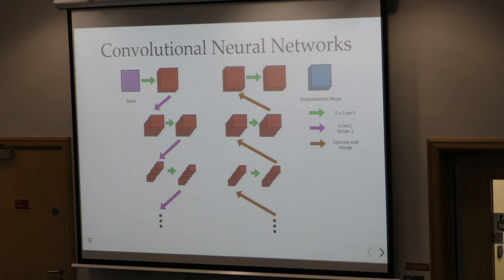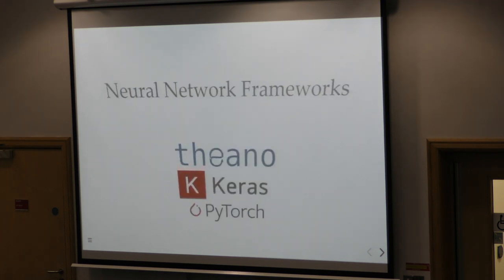And all these operations are very simple operations. It's just the combination of them that makes it seem complicated. And the only thing that we need to do to make our feature network work with our localization network is concatenate those images together and then do the convolution operation, which is a fairly trivial operation in terms of computer vision tasks. And that gets us our segmentation maps, which hopefully we can produce with good accuracy.